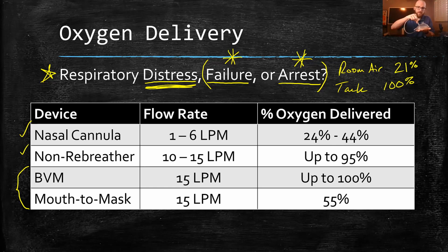And then we're going to supplement it with the oxygen coming from the oxygen tank. That's best case for the mouth to mask. They say it's preferred because you can generally get a better face to mask seal compared to even a one person BVM. But more commonly for us, we're not going to do mouth to mask. We're going to get our BVM out and do it that way.